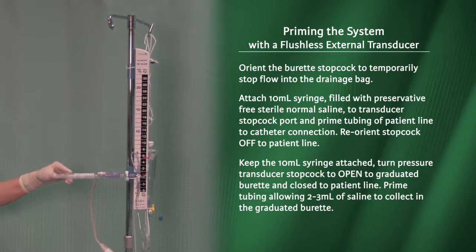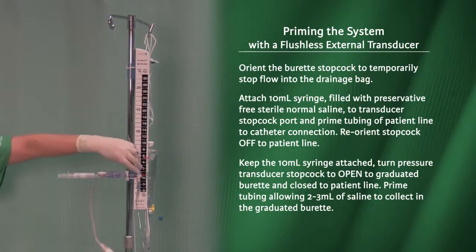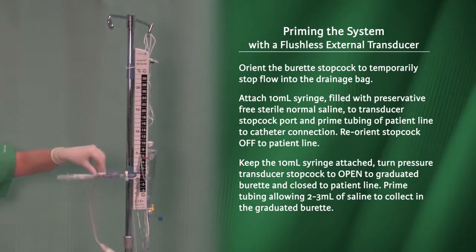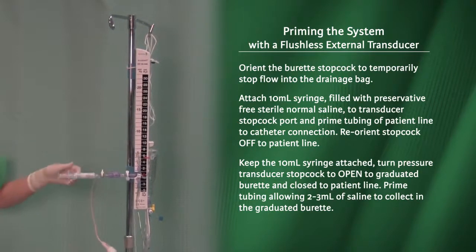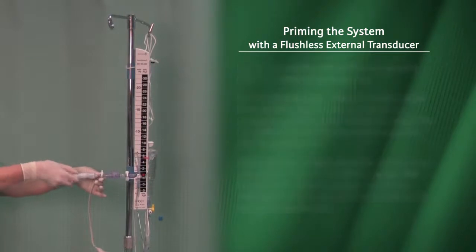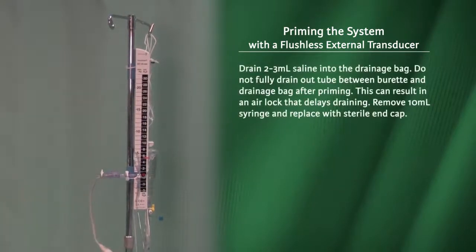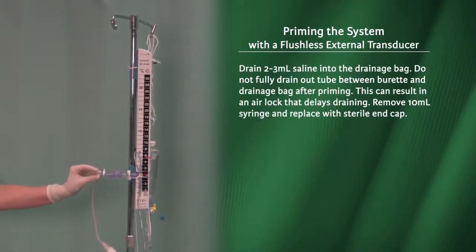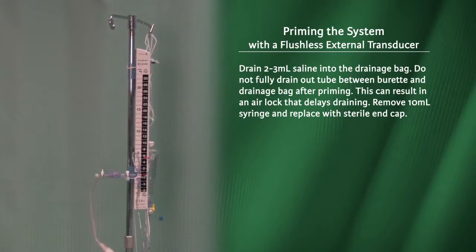Turn the pressure transducer stopcock to open to the graduated burette and close to the patient line. Prime tubing, allowing 2-3 ml of saline to collect in the graduated burette. Drain 2-3 ml of saline into the drainage bag. Do not fully drain out the tube between the burette and drainage bag after priming, as this can result in an airlock that delays draining. Remove the 10 ml syringe and replace with a sterile end cap.